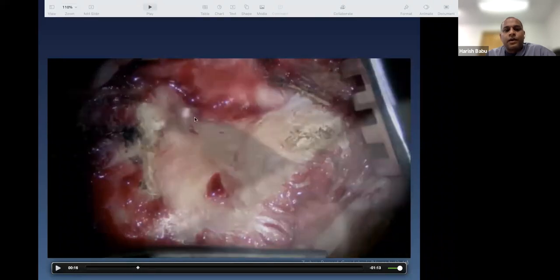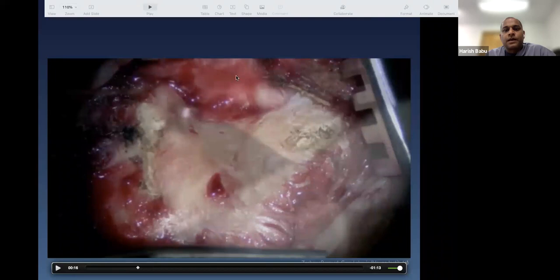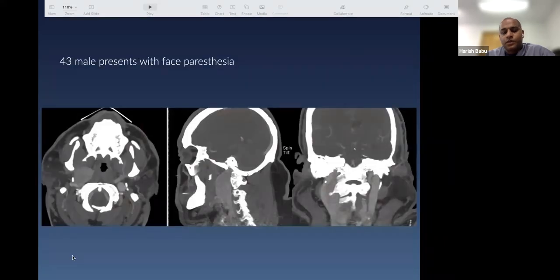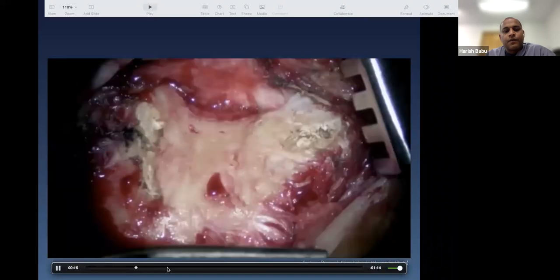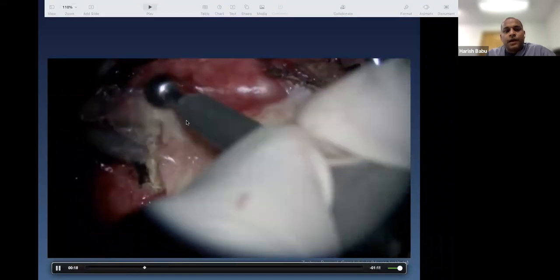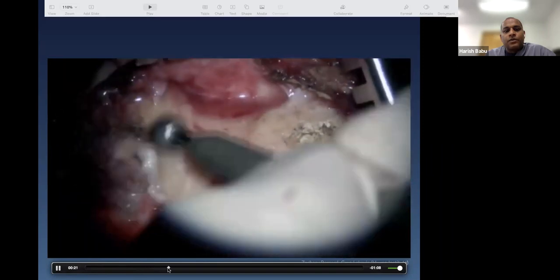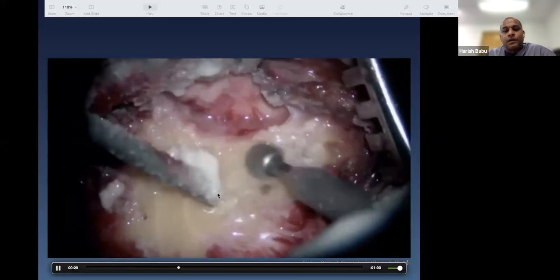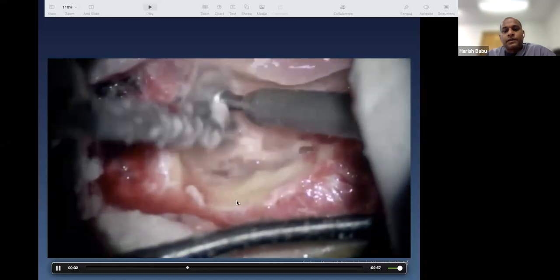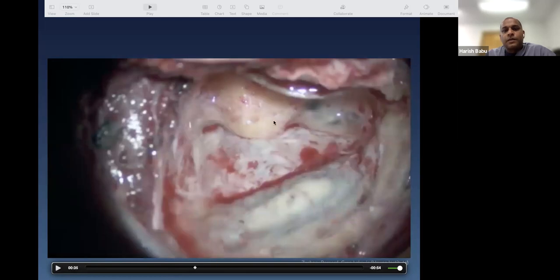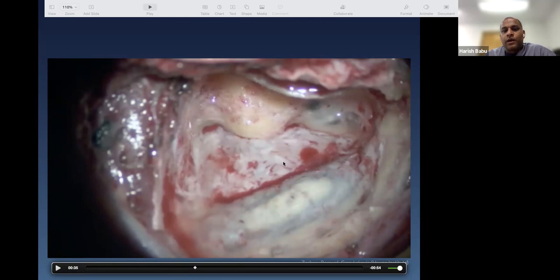Orientation: mastoid tip, external ear, top of head, approximate location of sigmoid sinus. The mastoid is drilled out, air cells and antrum are cleaned up. In this particular case, the semicircular canals were preserved and not transgressed. The sigmoid sinus is identified and this defines the window through which the pathology is reached.